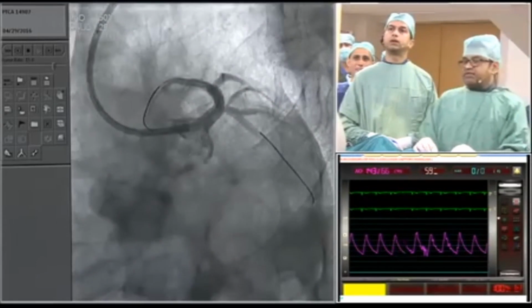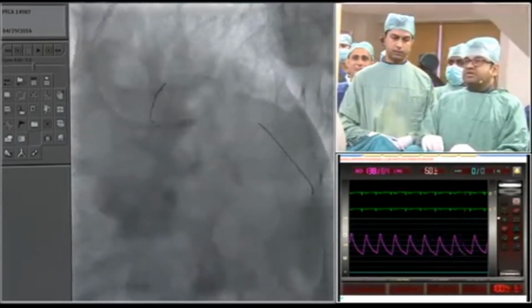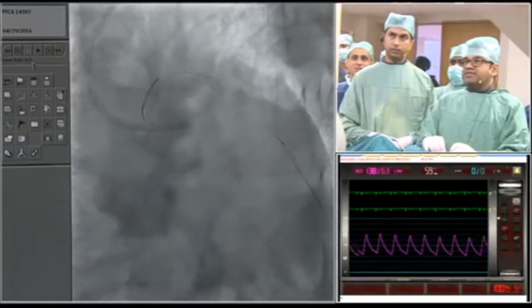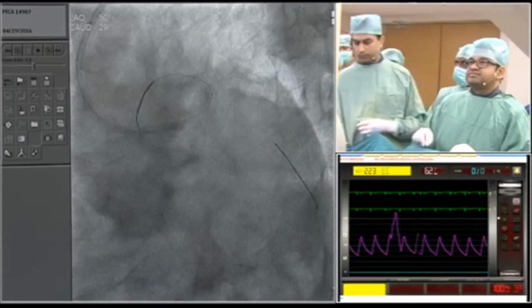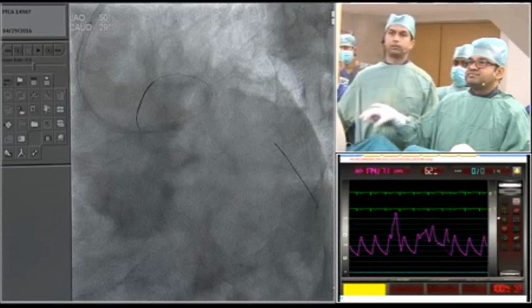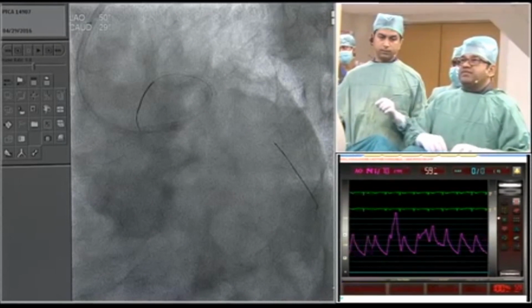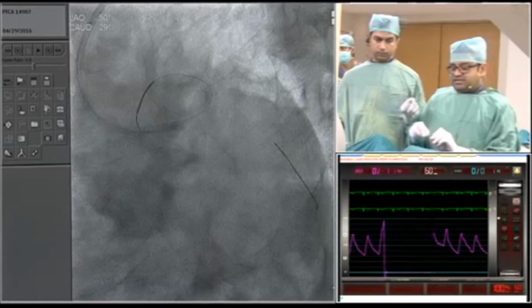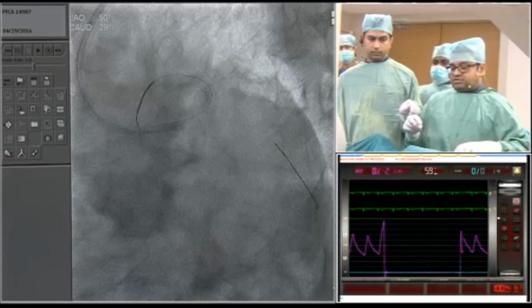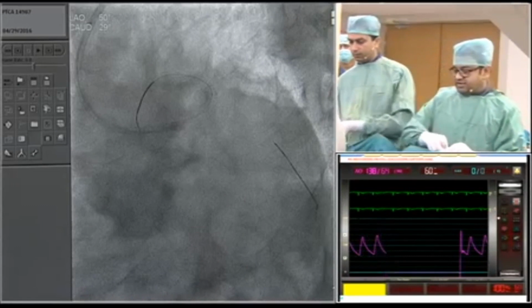I think there isn't enough data now to treat these with drug balloons. Do you have any experience of that? Anybody in the panel? Can you repeat, please? I was saying that if we have a drug-eluting balloon for the circumflex ostium, I understand. Drug balloon, yes. I will not do it. I don't want to use it, but I just wanted to know anybody's experience on that.